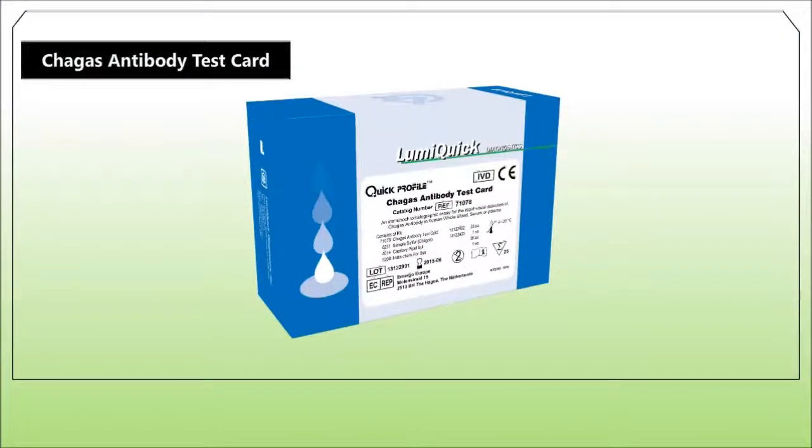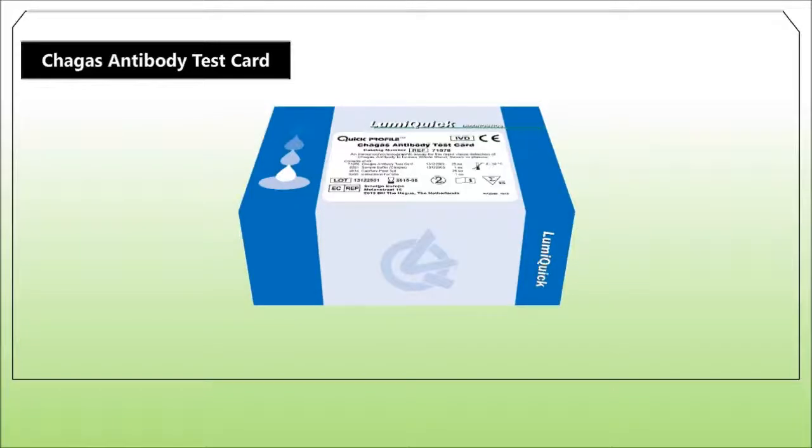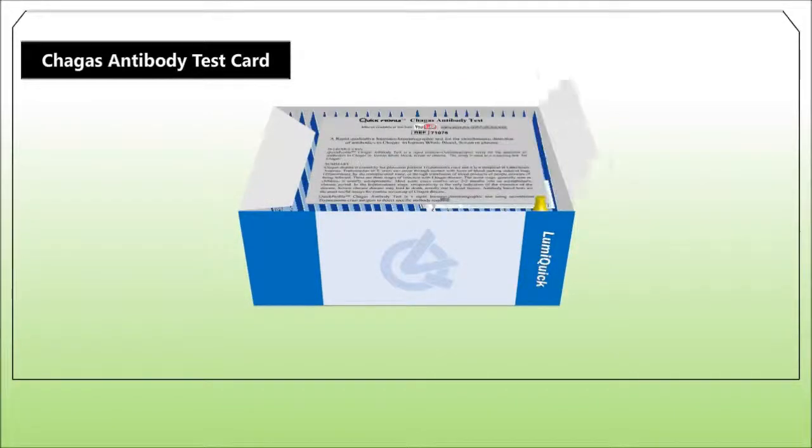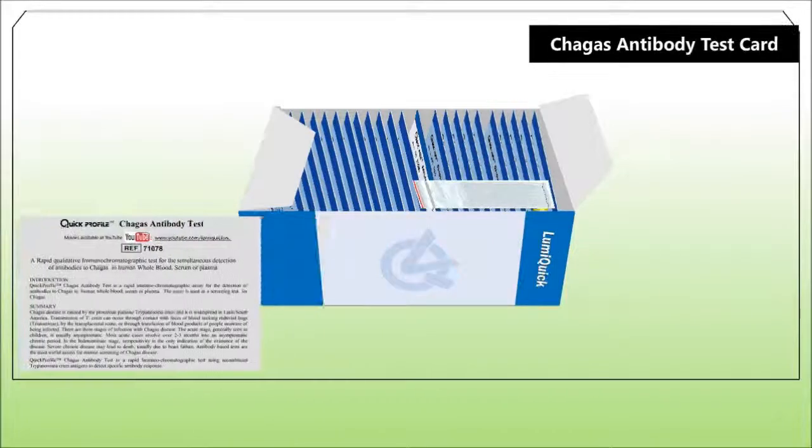Quick Profile Chagas Antibody Test is a rapid immunochromatographic assay for the detection of antibodies to Chagas in human whole blood, serum or plasma. The assay is used as a screening test for Chagas.